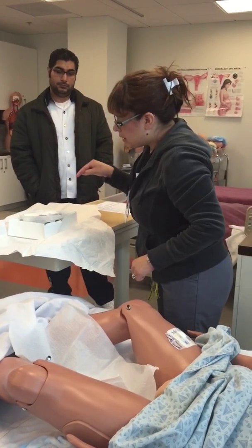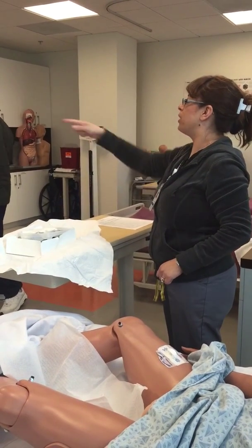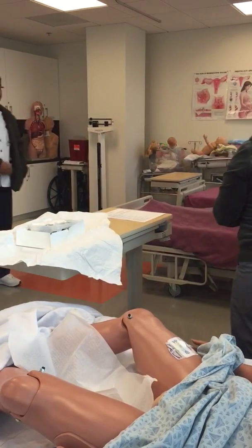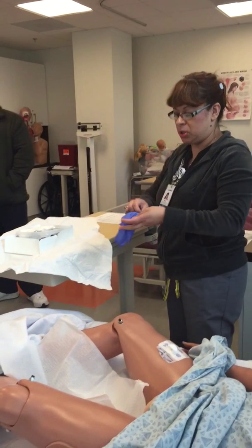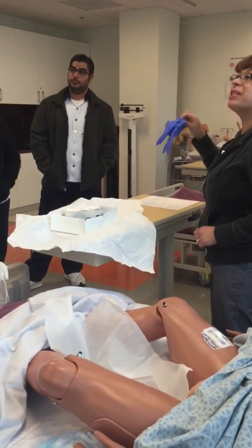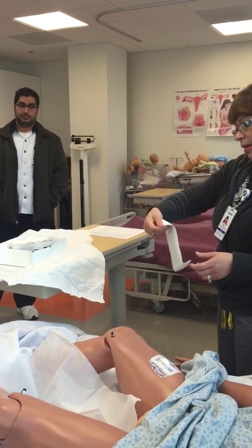I should have had a set of gloves next, and this kit doesn't have one. Can you grab me a set of sterile gloves? Is there a cabinet where it says gloves? See if it's open. Right there, on top where it says no foods or drinks. See that cabinet where it says sterile gloves? Is it closed? It's locked. Ah, all right. Let me make a set. Normally this would be in a package. This is why I like demonstrating with a new kit. So we're going to simulate. I'm going to grab that package. What size is that? Really big. Like a 9. Oh gosh. Okay, that's okay, I'll take it. Where's Nick? He was here all day, and now that we need him, he's gone.